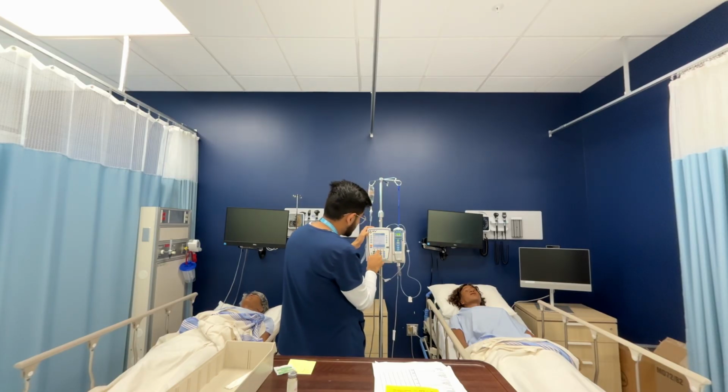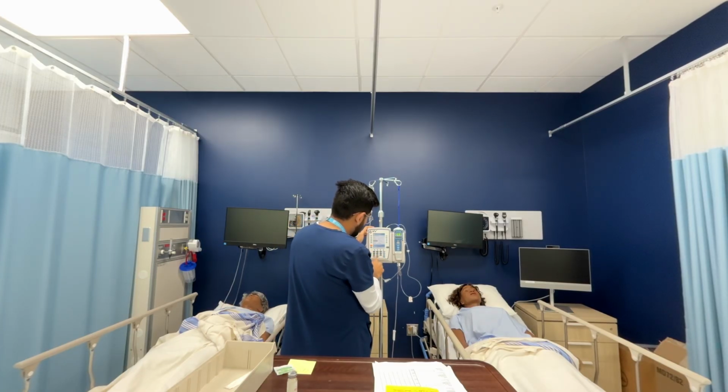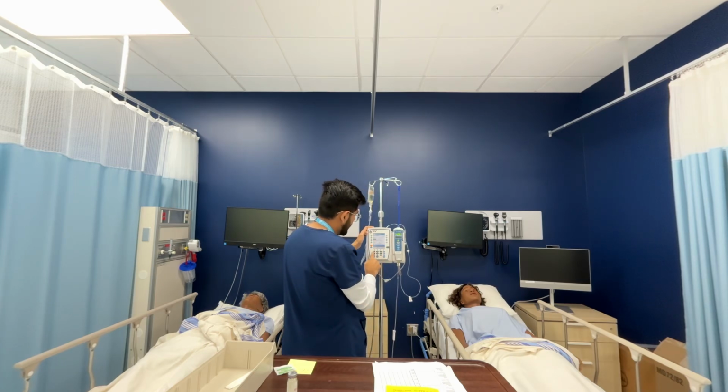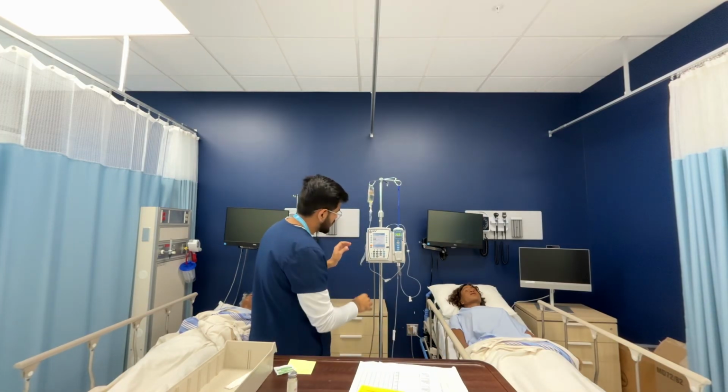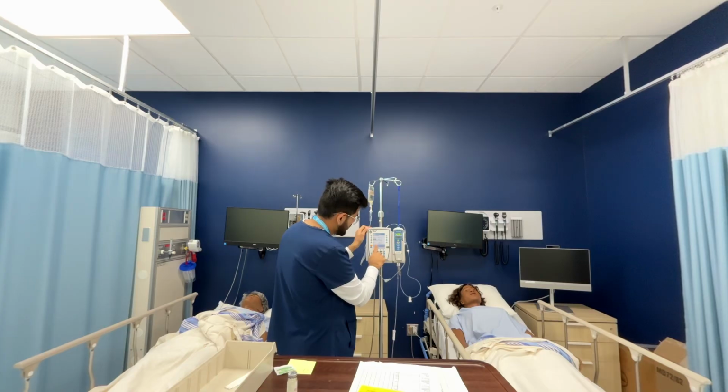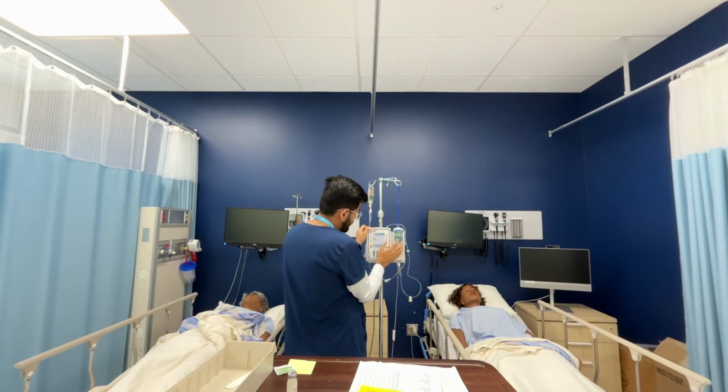I'll go next. According to my calculation, I have to select 1 hour, and I'm gonna change my volume to 100 because I have to give this medication at 100 ml per hour. So I've selected, and it is 80 mg, and I've calculated all the things manually as well. So it's ready to go. I'm gonna press start, and yes, and it's running properly.